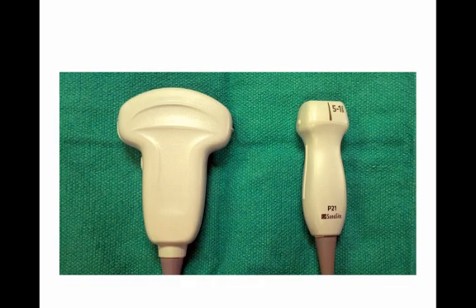On the right is a picture of the cardiac probe. Notice its smaller footprint in relation to the curvilinear probe. For the present time, we suggest you start with a curvilinear probe as it may be easier for you to handle initially.